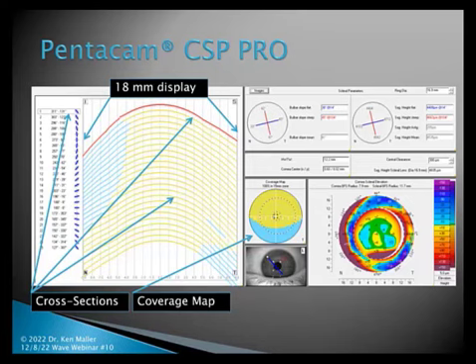In this example, I held the upper lid up and took the first scan, which is why the yellowish green color goes all the way to the top, and then just pulled the lower lid down for the second scan, and that's the turquoise color that got added into the bottom. If you can get the lids open all the way, you can do all that in one single take. You don't need to split that up.